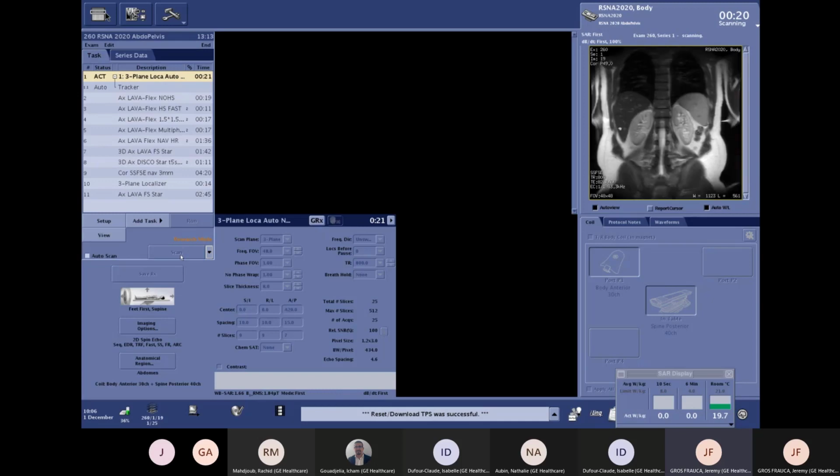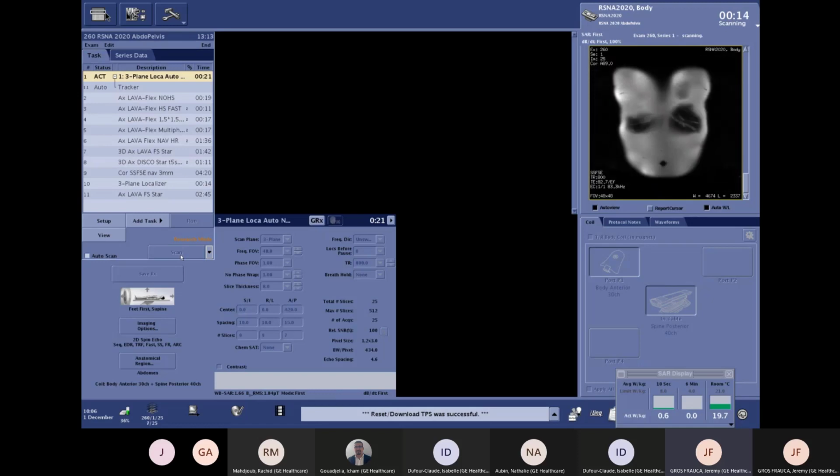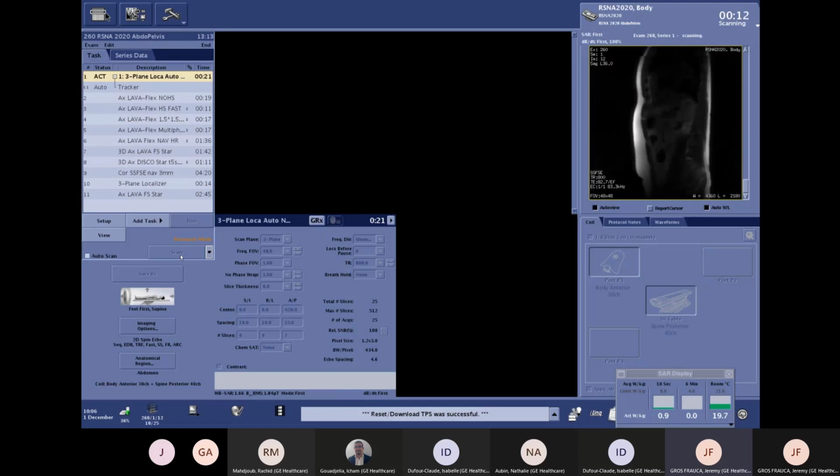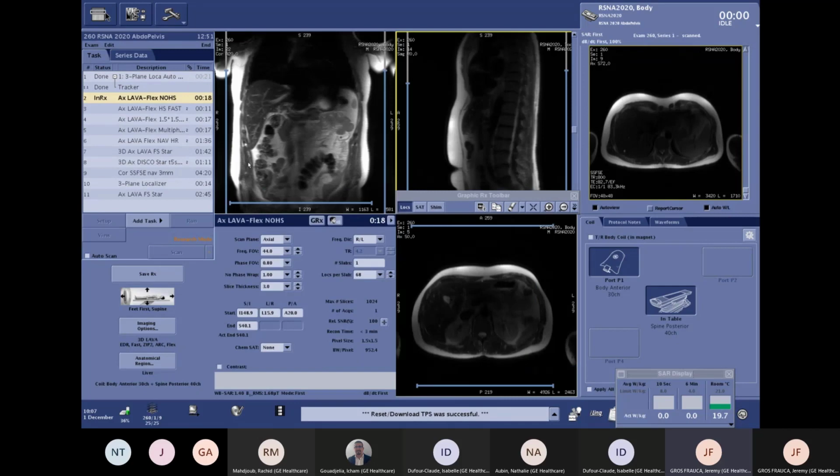But there still remain some challenges when using MR. The two main challenges that you are still facing at the moment are dealing with the breathing pattern of the patient and sometimes the lack of signal-to-noise ratio. So let's together today try to understand how we are addressing those challenges with our solution and how we are trying to help our customers on that subject.